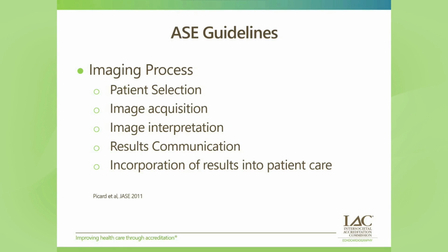Components for results communication include key elements for reporting the interpretation, amending the report when necessary, timeliness of the report, and reporting of critical results. All echocardiographic reports should follow a uniform outline. If an amendment is made to a report that results in any substantial change, then the summary should describe any action that's been taken. Studies should be categorized as stat or routine.